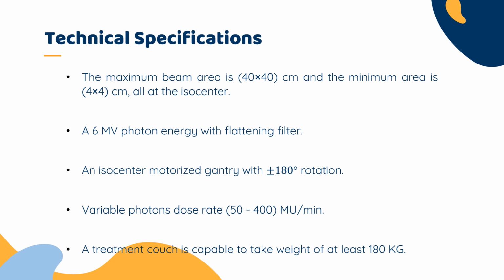A treatment couch is capable of taking weight of at least 180 kilogram. And these are some, not all, of the specification of the LINAC.